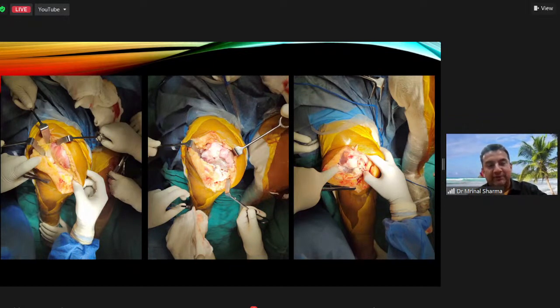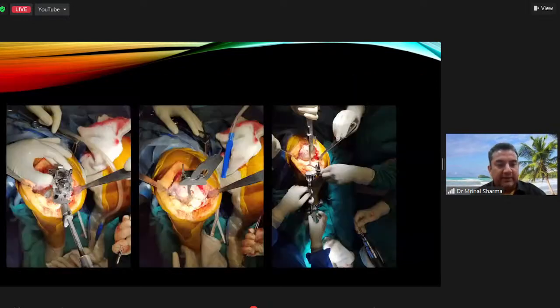The hypertrophied VMO, or the medial quadriceps, was actually excised, meaning the joint was opened through that skewed scar. Then I went inside, and you see the high osteophytes which were there, which I couldn't find on the X-rays itself. They were pretty hypertrophied, and there is obviously a defect in the tibia, and a hypoplastic lateral femoral condyle, the typical things which we see in a valgus knee, apart from a patella baja. So there could be skin problems, bony defects, and a need for a long stem. All these were planned. I did a 3-degree valgus cut, did the distal femur first, and hardly any bone was cut from the lateral femoral condyle, as is usually seen.